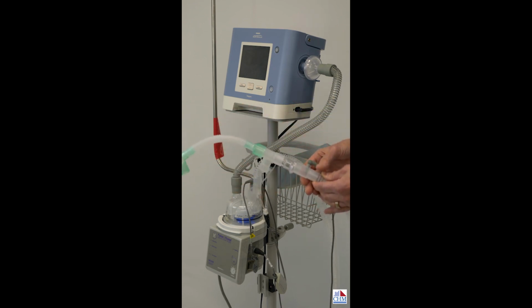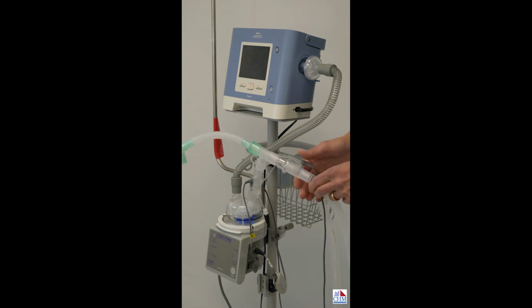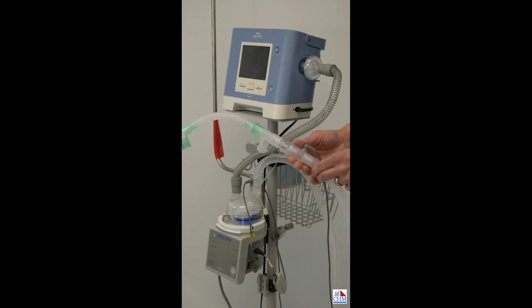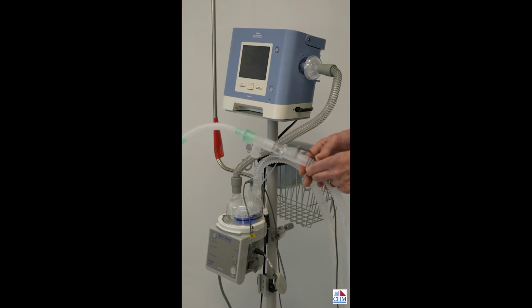So to prevent the buildup of carbon dioxide, we have this leak, so it's constantly flowing air out of it. We've got a constant leak here of about 25, maybe 30 liters per minute, constantly coming out of the whisper swivel. That's how we're able to achieve ventilation and blow off that CO2, or carbon dioxide.